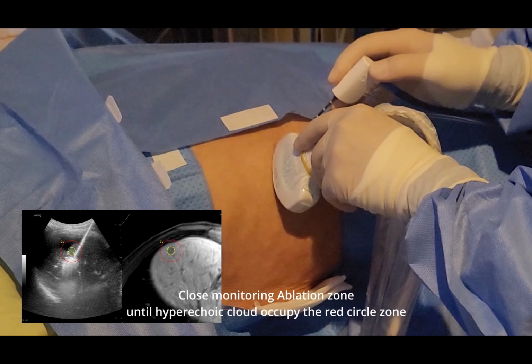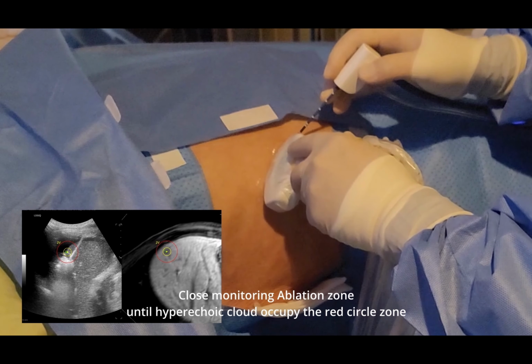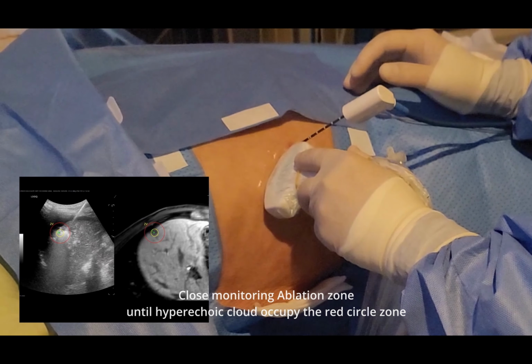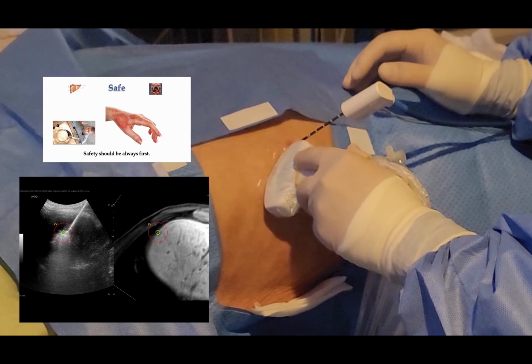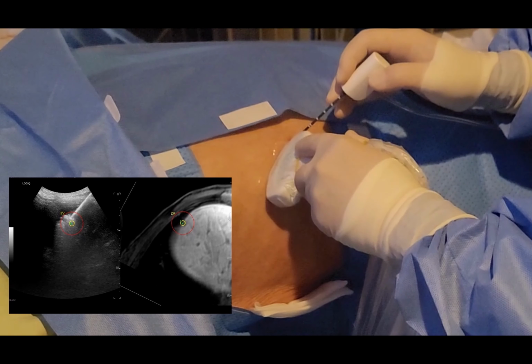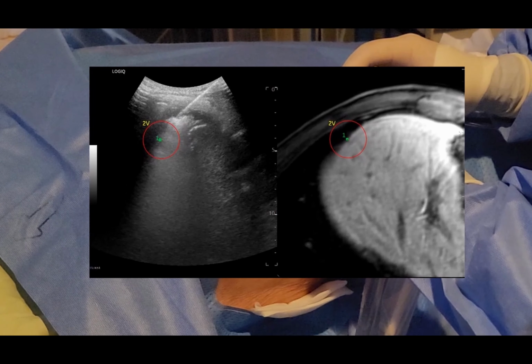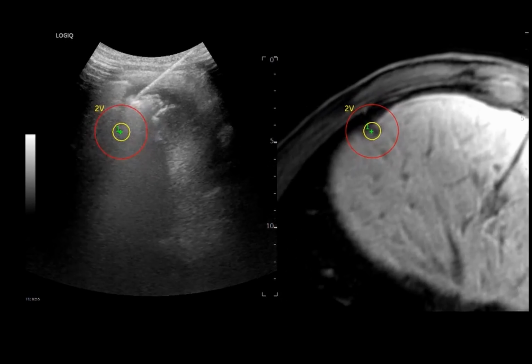And during the ablation, we should monitor closely to be optimal. Okay, the ablation zone has covered the tumor itself and is approaching the anterior ablative margin. So don't worry about thermal ablation injury, because of the artificial ascites. Okay, it's time to remove the electrode.